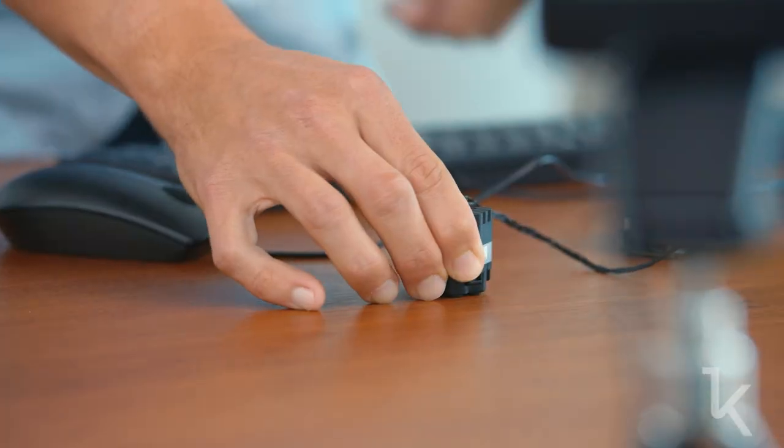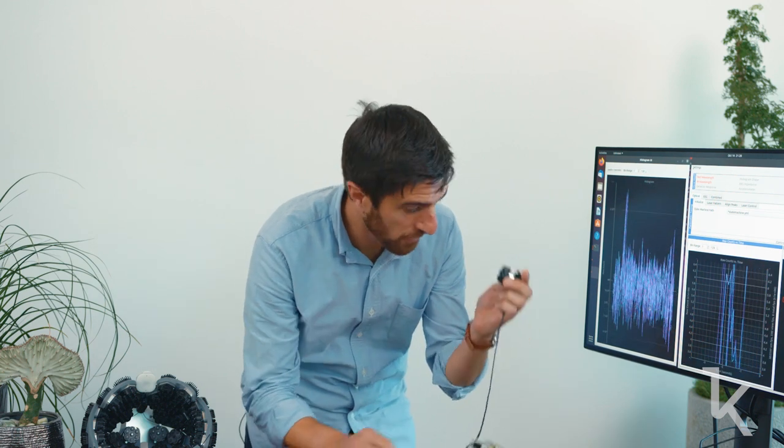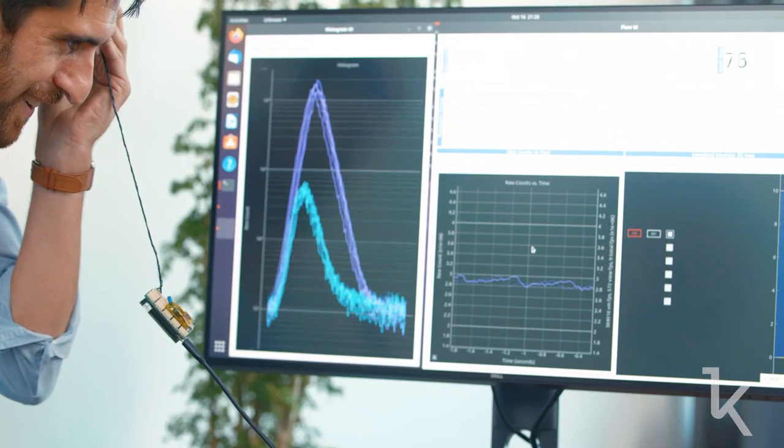I have it face down on the desk right now. If I compress it, the noise goes down — it's just a counter, no phantom, no scattering material, just a desk. If I put it on my hand, you can see the histograms on the left changing and total counts on the right starting to change. Then I'll use both hands and get a heartbeat signal off my forehead. There it is — I see it. And that's CW equivalent. We're updating at 200 Hz.